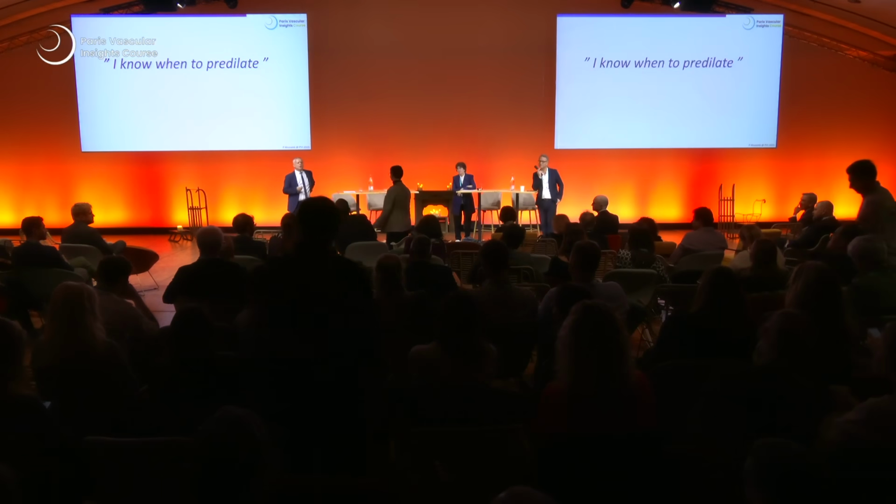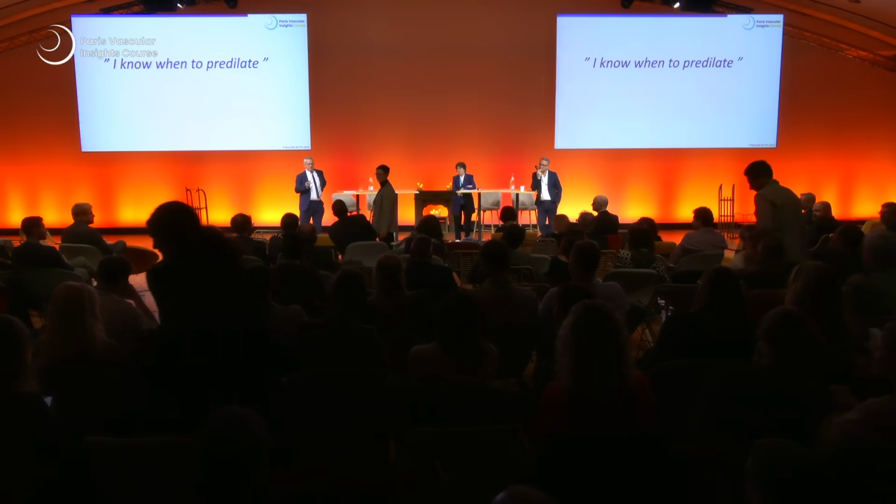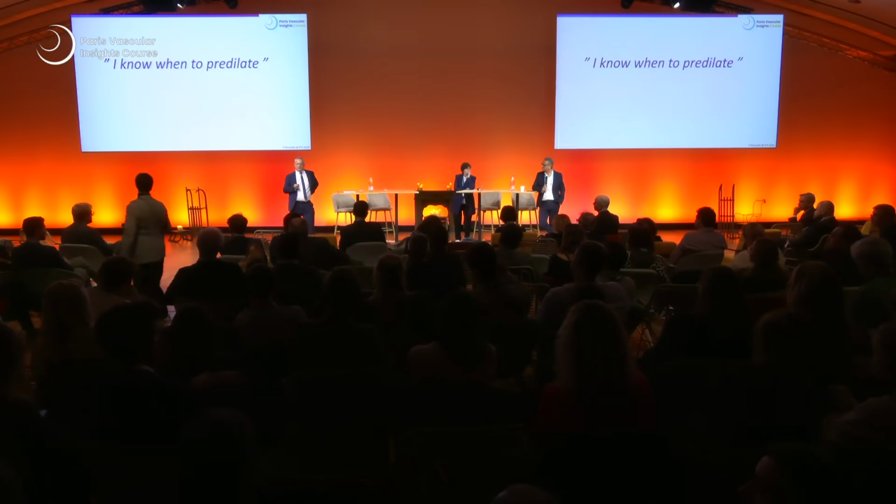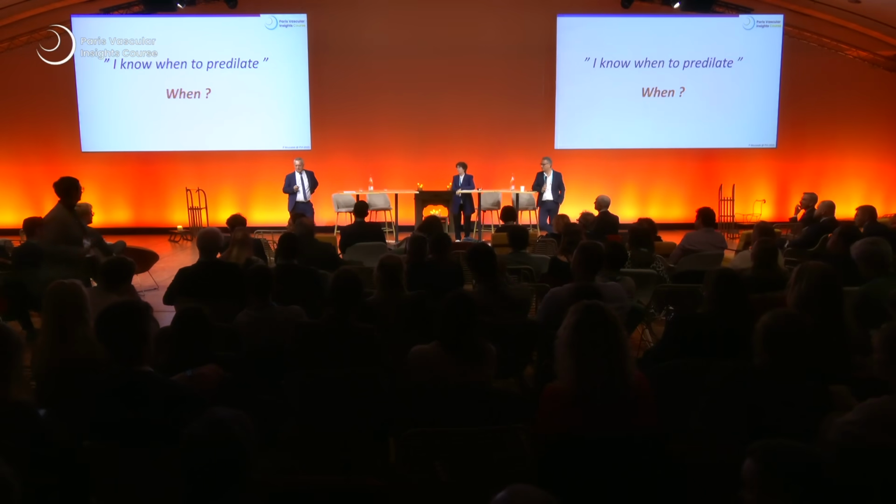That's getting really interesting. So how do you evaluate the plaque? Ultrasound. Ultrasound in your hands. Yeah, obviously. Okay. Anyone else? On the, just before the operation, not the ultrasound that brought the patient to the hospital. Okay, so we look at the plaque prior to the intervention. Any other ideas? Angio? Angio may not be sufficient to make this decision.